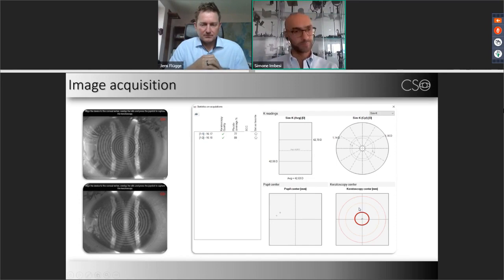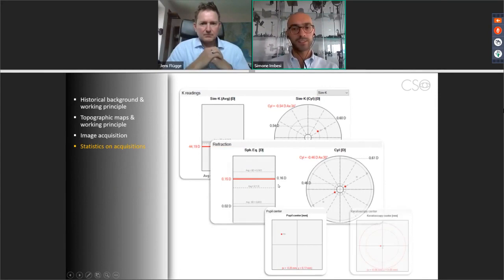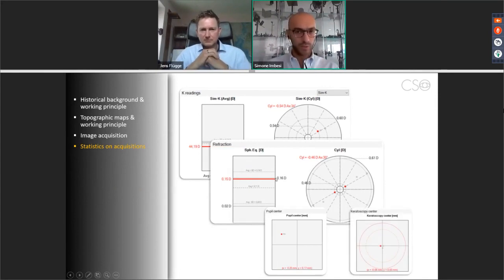Okay, so let me use this slide to introduce this kind of report that you can get after all your acquisitions.